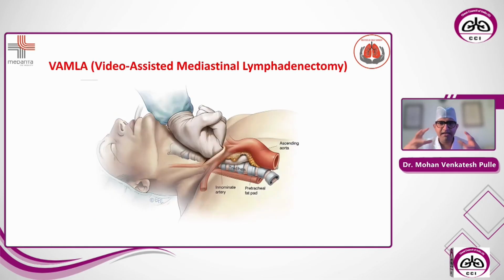And then with this bidexterity, which comes to the surgeon because of the separable blades and enhanced imaging, people started doing extended, significant mediastinal lymph node dissection also, not only sampling but dissection, which is called VAMLA, video-assisted mediastinal lymphadenectomy.